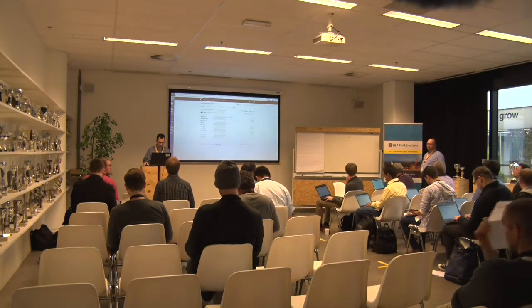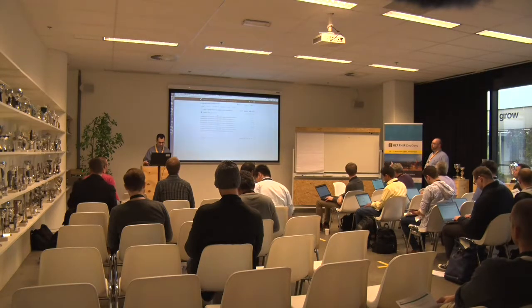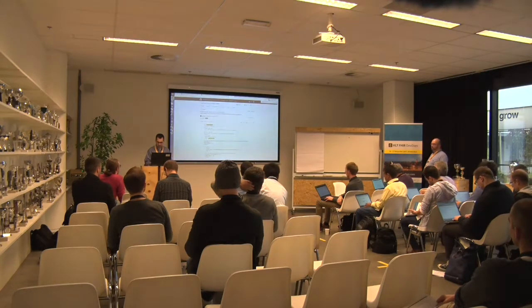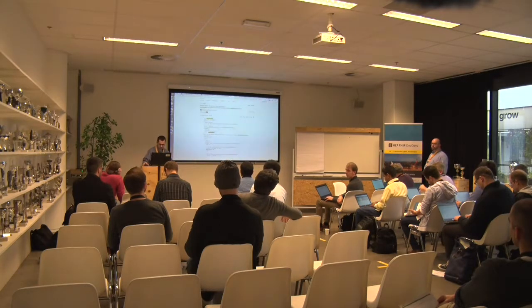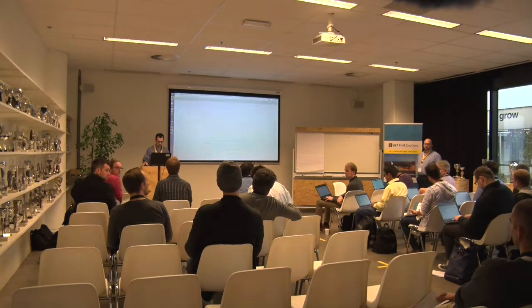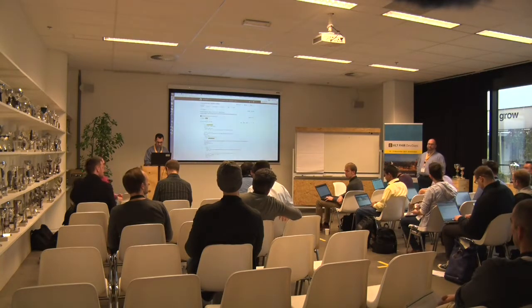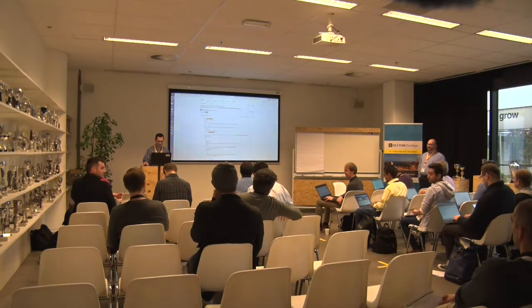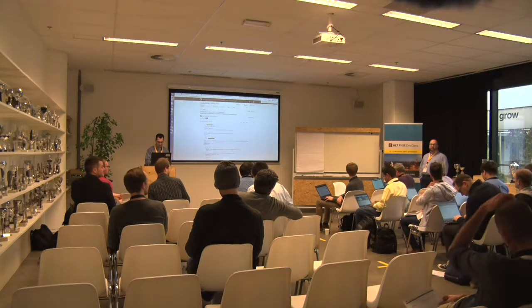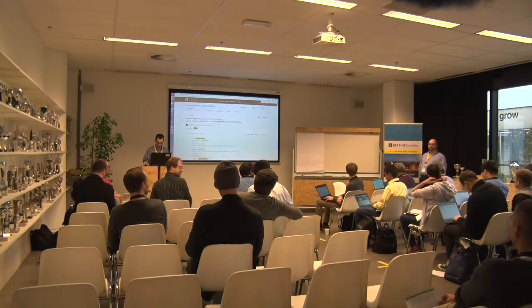Right, yeah. It is a field at the study level, but maybe this dataset didn't have it. I think it is optional at the study level, but it's mandatory at the series level. I was explaining, but sometimes it is on instance level. So there can be a series with images of different modalities? No, it is forbidden. We have seen that. They're committing a DICOM crime. Call the DICOM police. Yeah, no, it happens. I believe that it happens. I've seen lots of bad DICOM.